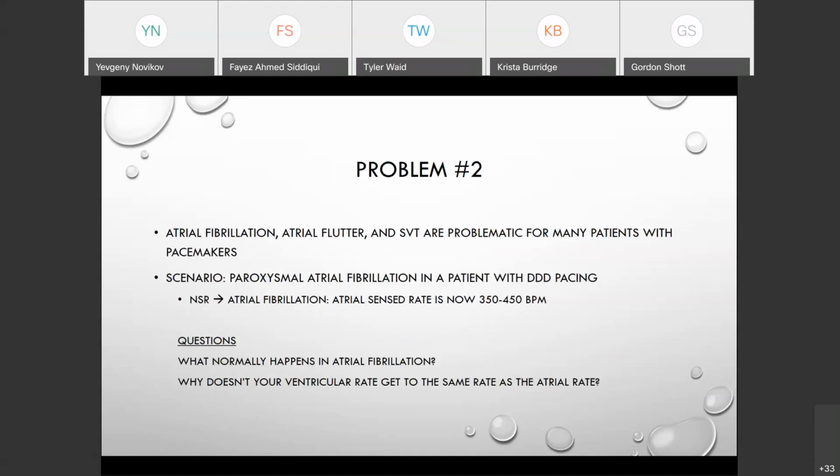Danny asked if this is an essential, a standard feature. Yeah, usually people will have rate response, but it really depends on the pacing mode. So if you don't have any sinus node disease, you really don't need rate response, because if you're chronotropically competent, meaning that your sinus node's able to pick up in the event that you're exercising, then you really don't need rate responsiveness. Because if you are able to accommodate it, your sinus node's going to pick up with exercise, and you can use your other pacing modes to keep up if you have AV node disease.